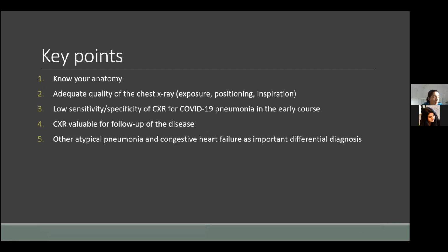This is my last slide, with some key points to think of. We started with anatomy. This is really important. Just know your anatomy when you're looking at a chest X-ray. The second point is adequate quality of the chest X-ray before starting with examination and assessment. Look at exposure. We talked about positioning and inspiration.